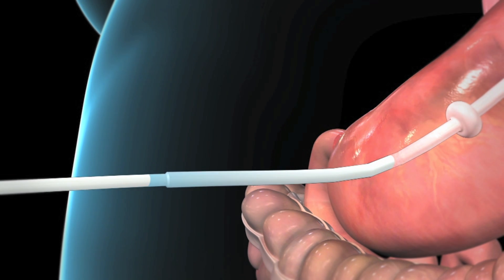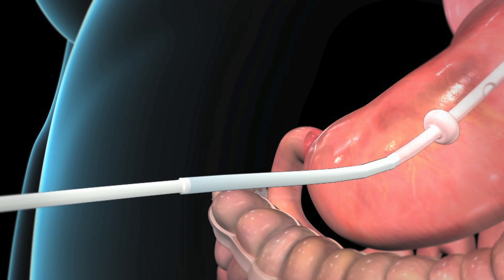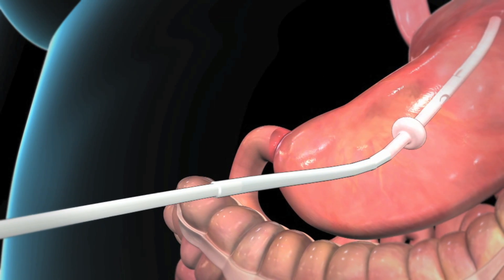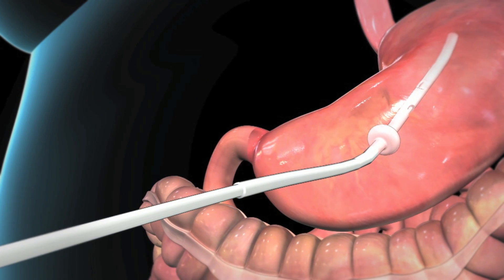Your doctor will continue to pull until the tip of the tube comes through a small, one-centimeter incision in your abdominal skin.